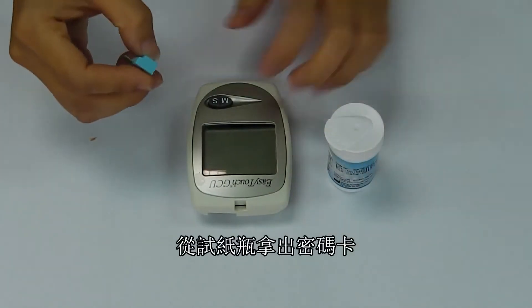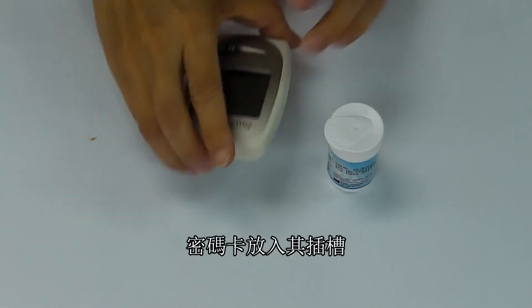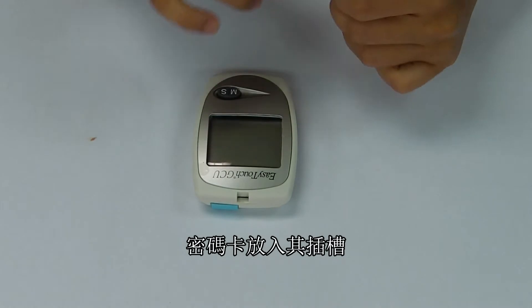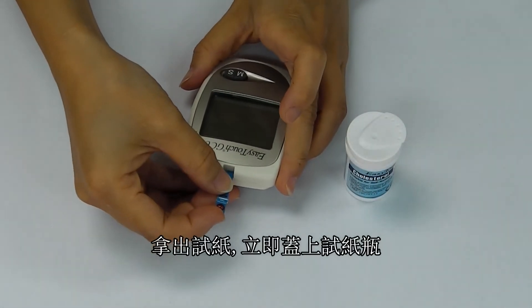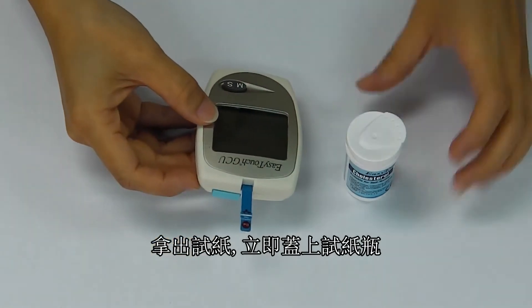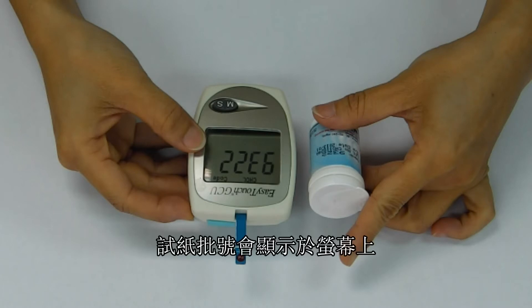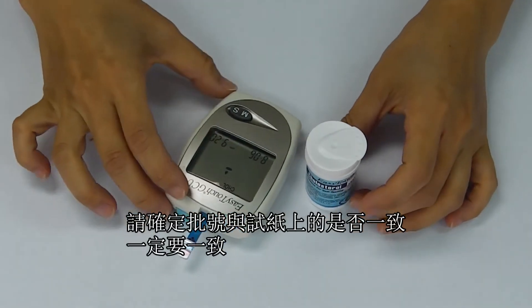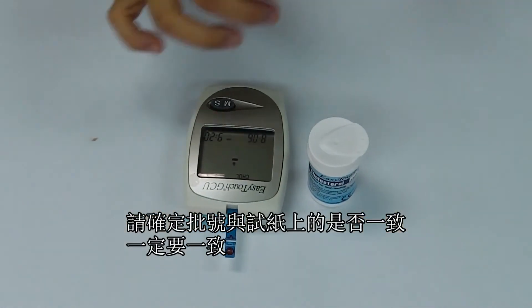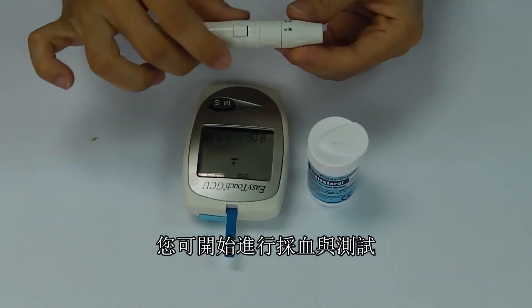Take out the code key from the test strip vial and insert it into the code key slot. Remove a test strip from the vial and close it immediately. Insert the test strip into the test strip slot. Note the code number displayed on the LCD and be sure that it matches the code number on the test strip vial. Your meter is now ready for a blood sample.